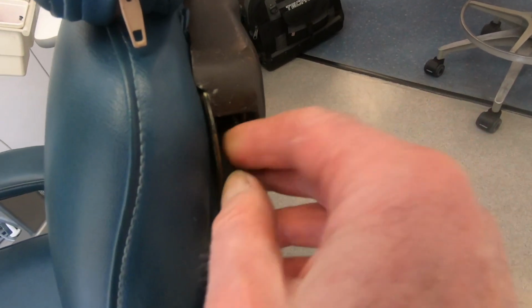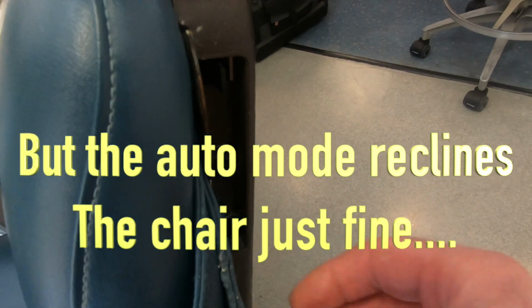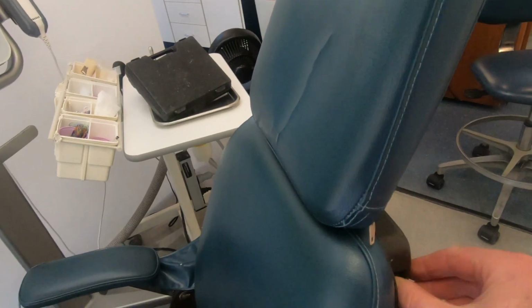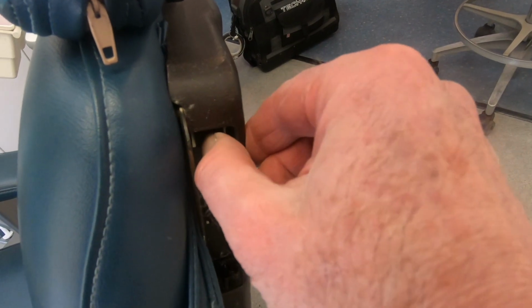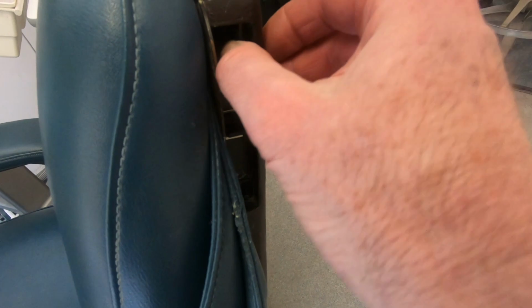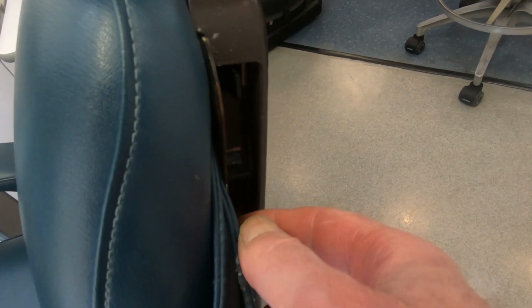Back doesn't work. But when I push this, so in my case, it's the left and right hand side have toggle switches, and when you push them backwards, either side, the chair doesn't go backwards. I actually ran a temporary wire from the switch all the way to the board, which is by the foot part of the chair, and it actually worked. So somewhere the wire is messed up, somewhere between the back of the chair and the front of the chair.